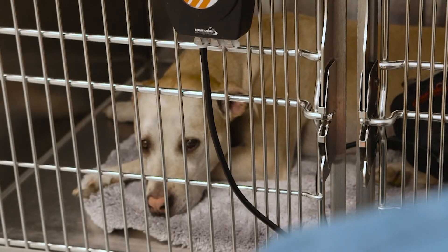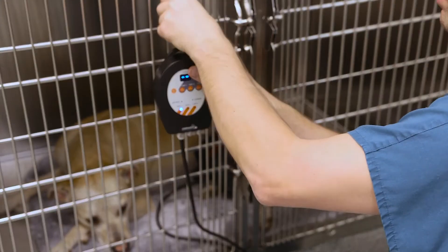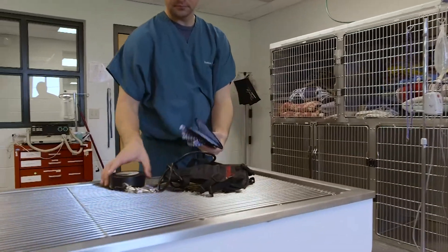It provides us great flexibility for muscle injuries, for patellar tendonitis, for dogs that have arthritis that need some extra boost. It's easy for clients to utilize at home to get some benefit after a long workout for those arthritic patients. Commonly when we send it home with patients, it's for the immediate post-operative period, and then we're going to have them doing it two or three times a day for the first two weeks.